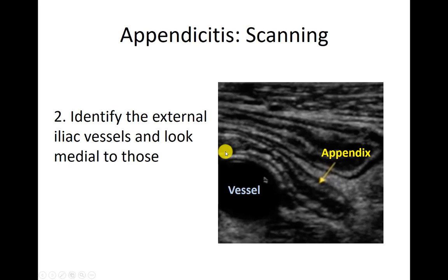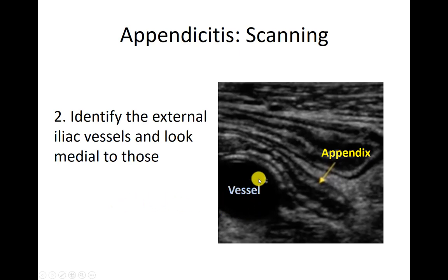This is what bowel looks like — a layered structure that's hyperechoic with some hypoechoic inside it. The key to the appendix is that it's blind-ended, meaning it terminates at some point. So if you identify this vessel, follow it and make sure it comes to a circle — a blind end. Another loop of bowel, by contrast, would just keep making a tubular shape and never finish with a circle at the end.